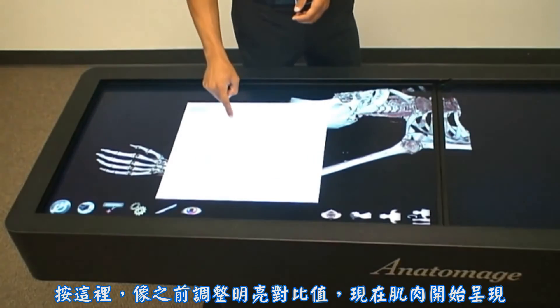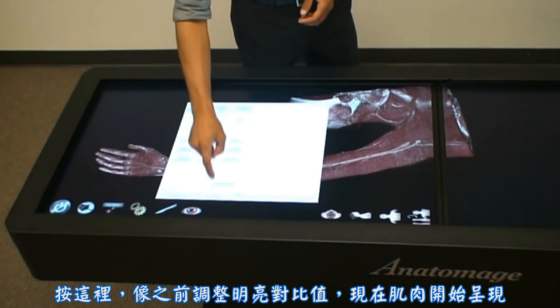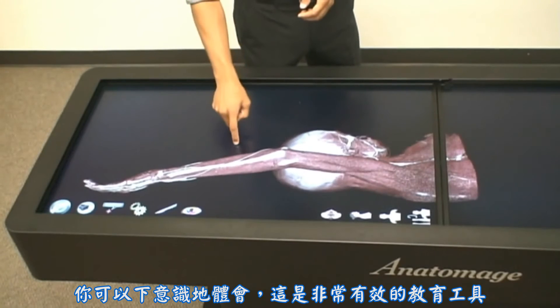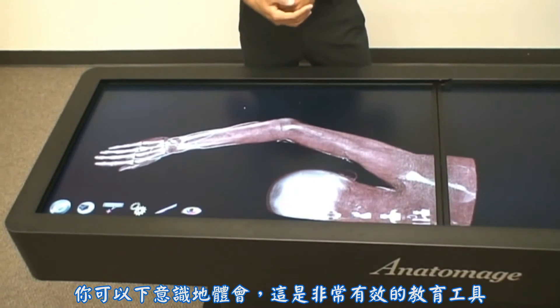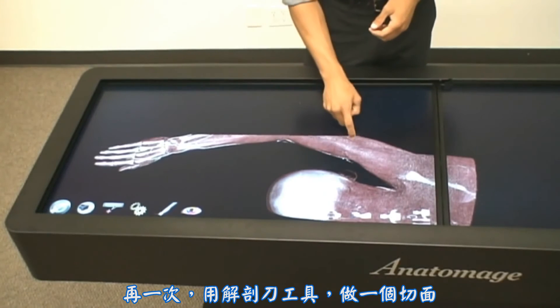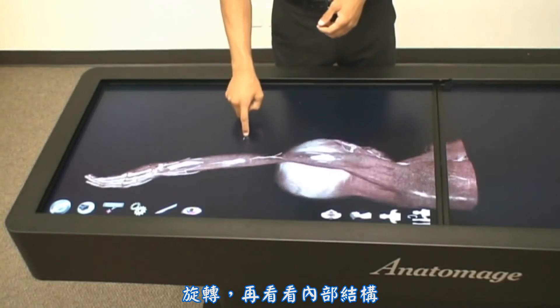Pressing on this allows us to adjust the brightness and contrast like before. Here we're bringing in the musculature and looking at the upper limb. With the use of contrast media, this could be a very effective educational tool. And again, with our scalpel tool, we're able to create our own clipping planes and rotate around to see internal structures.